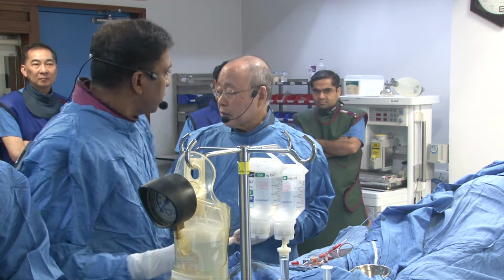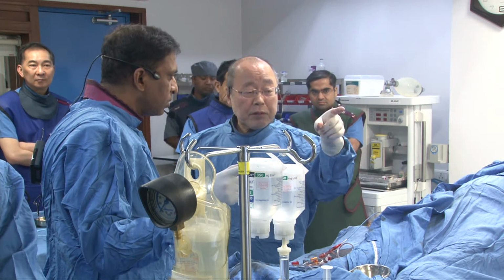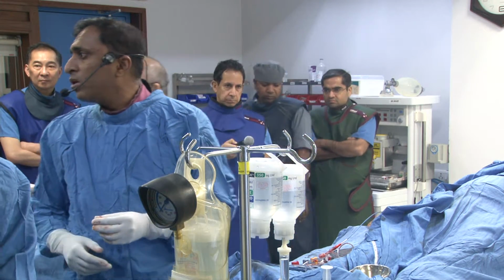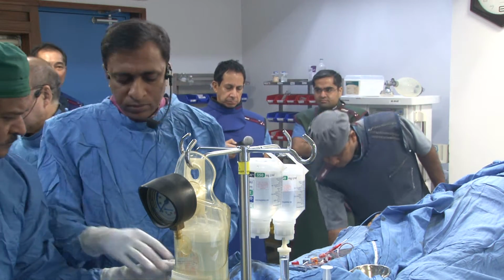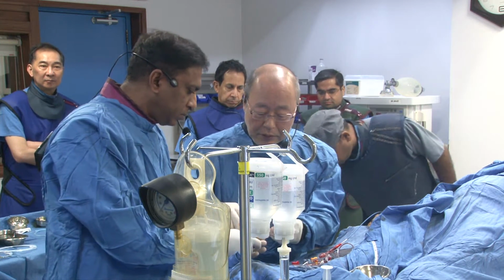Okay. What balloon do you use? 1.5 millimeter balloon. 1.5 alone. Fielder FC? This is Fielder FC. Okay.